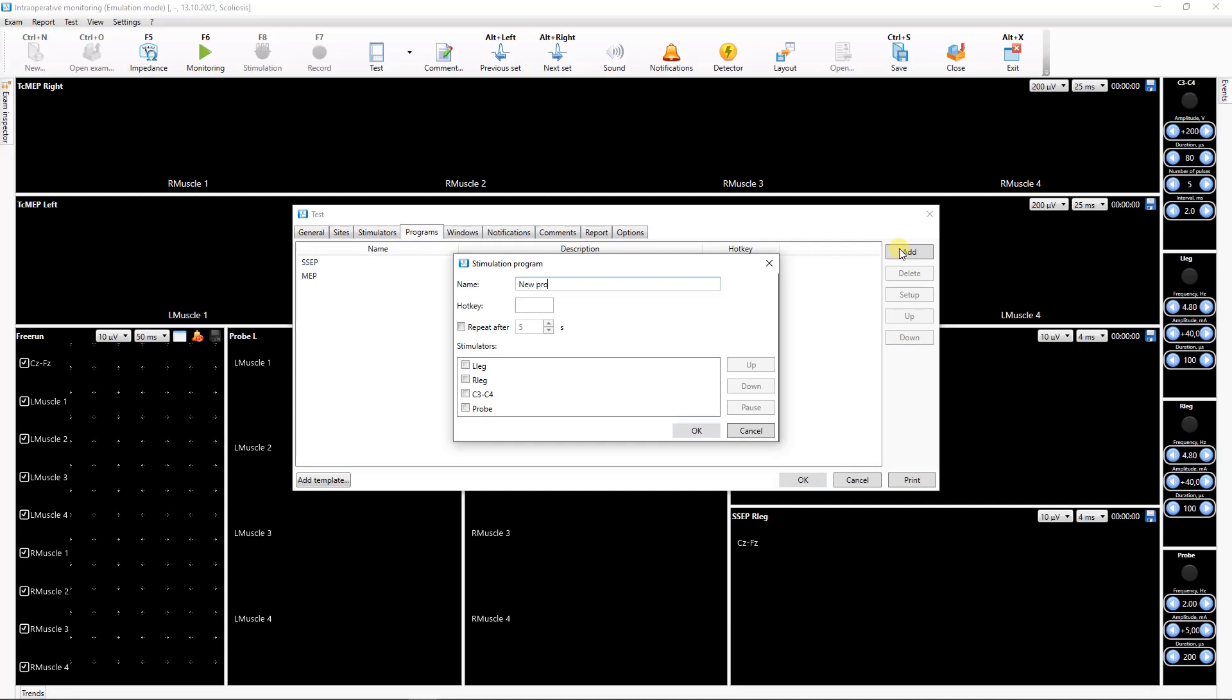To add a new Stimulation program click Add button. In the opened dialog box you can enter the Stimulation program name, specify hotkey to quick program start and activate the repeat after checkbox, which means that the program is repeated at a specified time interval.